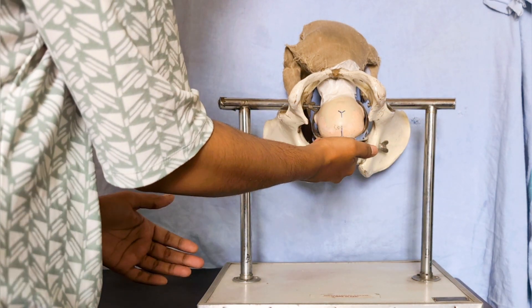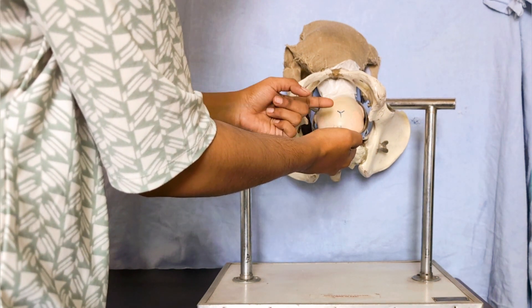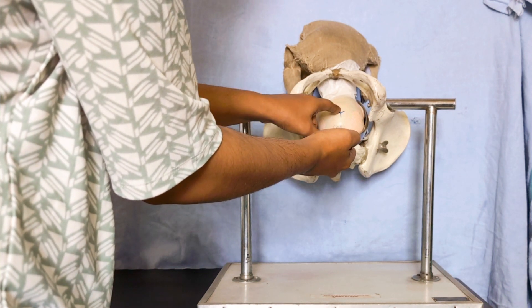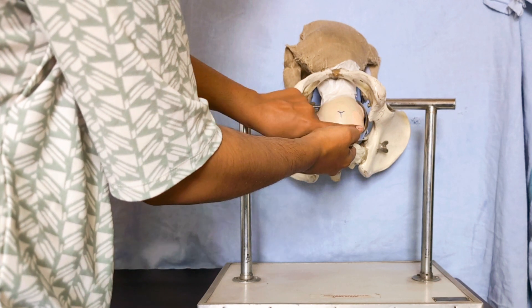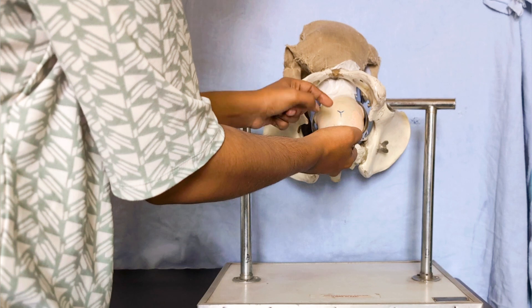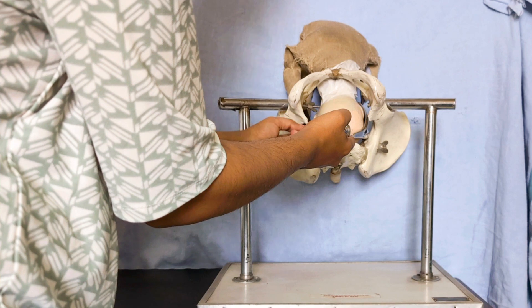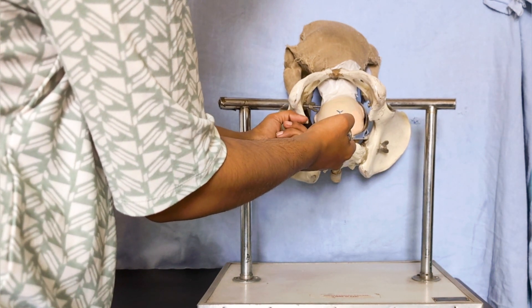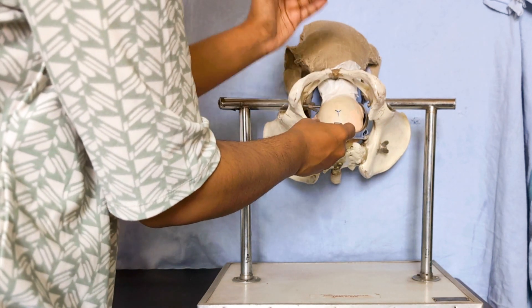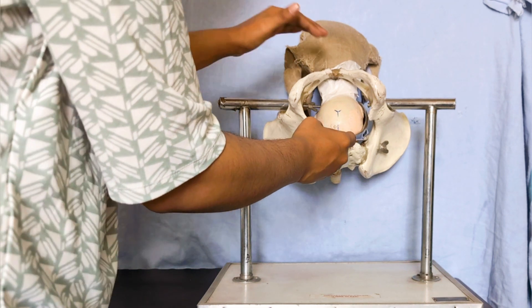To confirm correct application: the sagittal suture should be perpendicular to the handle — right in the midline. The posterior fontanelle should be equidistant from both blades, and should be one finger-breadth above the level of the shank. The fenestration on each side should admit just the same amount of finger-breadth on each side, confirming it is a biparietal bimalar application.